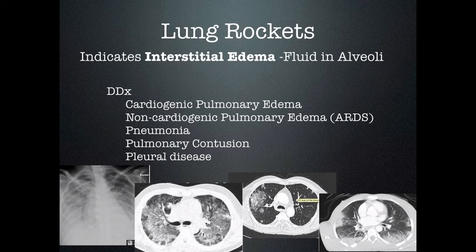And when you think interstitial edema, think of fluid in the alveoli. This is not exactly the case. It's really fluid in the interstitial septa, but if you think of it as fluid in the alveoli, it helps you with your differential diagnosis.